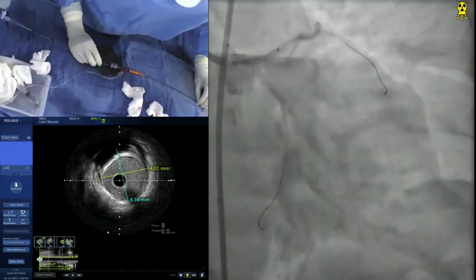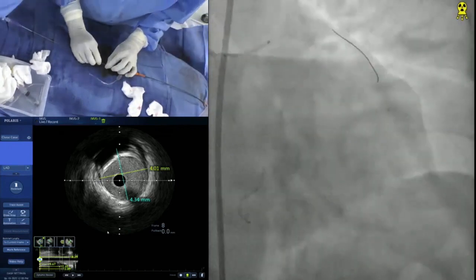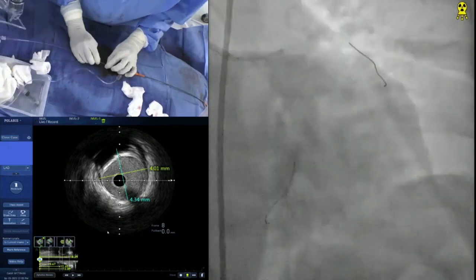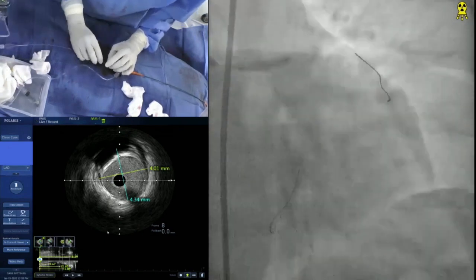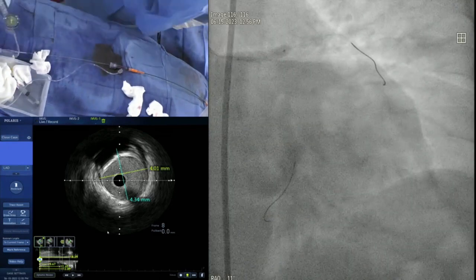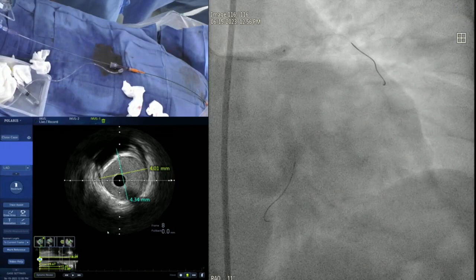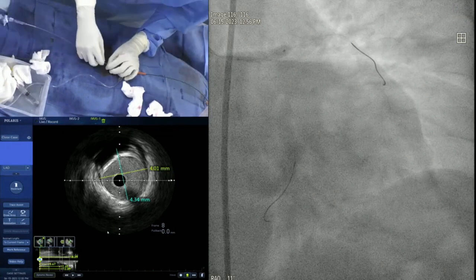Ready? Yeah. Outside. Okay, good. Go up. Yeah. Roxana, I'm going to quickly make a point here. Yep, go ahead. You know, I sort of partially agree with Antonio, you may not have had IVUS that circ. No. But if you IVUS beforehand, you'll see the circ. Even when you're going down the LAD, you get a side view of the circ and you can tell if there's anything there with the ostium.